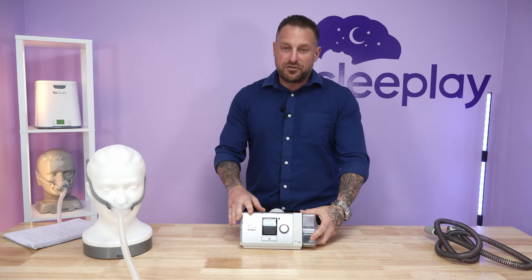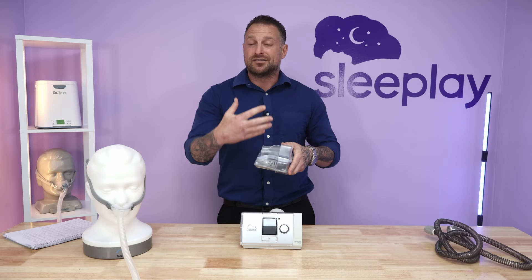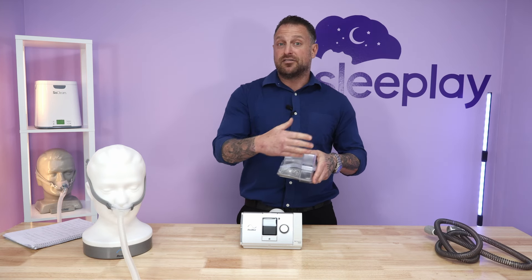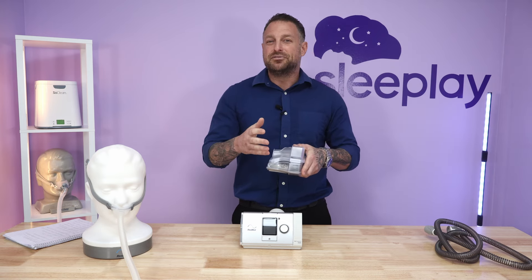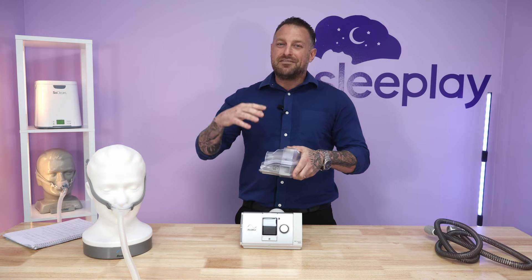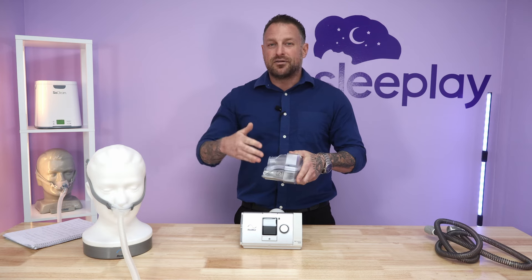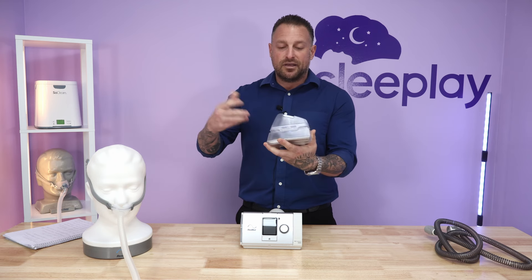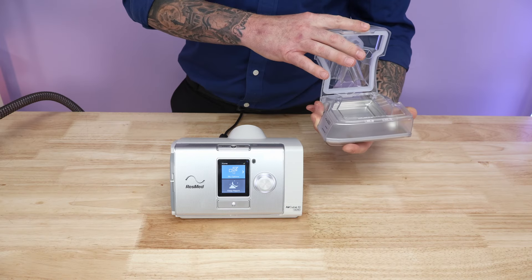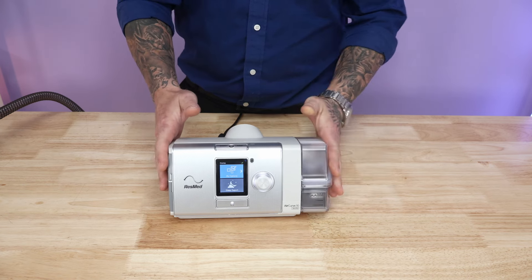It's a standard water chamber with a max line, as I mentioned in previous videos on the AirSense 11. You'll fill it up with distilled water — you can use filtered, purified, or even tap water, though with tap water make sure you clean it immediately after use so calcium doesn't build up. Open up the water chamber, fill it to the max line, close it, and it pops right back in.